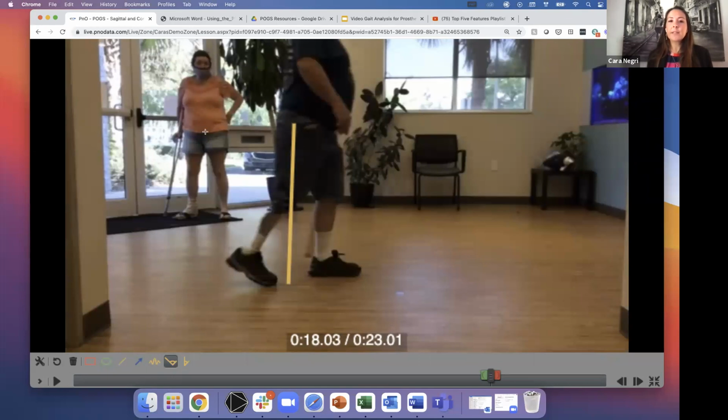If you have the ability, so lighting is also a big deal, to Dr. Havorka's point, as far as measurement errors and these darker colors. So if you have the ability to place a light, I probably could have put a small little LED light here that would really help me with this video. So that's another thing that you can do.